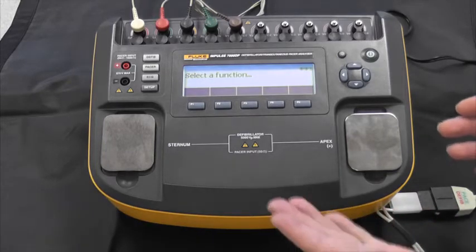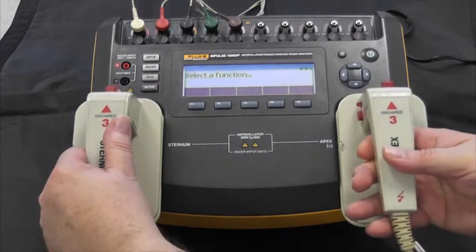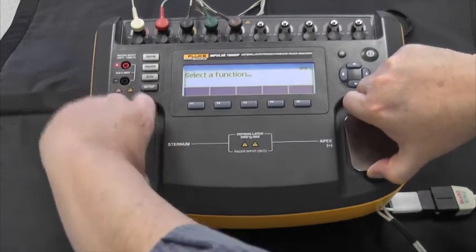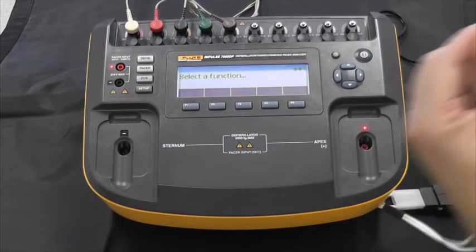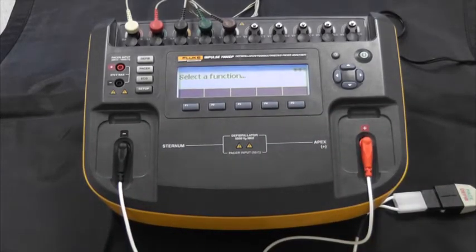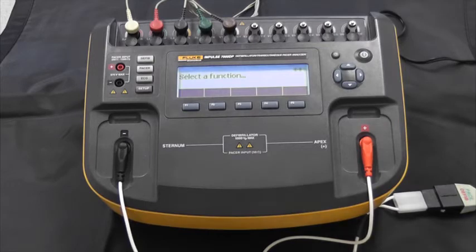As you can see, we have it set up with the plates — if you're going to use paddles, they just go right on the plates just like that for you to control the defib and deliver the energy. Or we can remove the plates and connect the quick combo leads. Those adapters you can get right from Fluke Biomedical, and they connect up nicely — they're really hands-off so you don't have to worry about any energy mishaps.